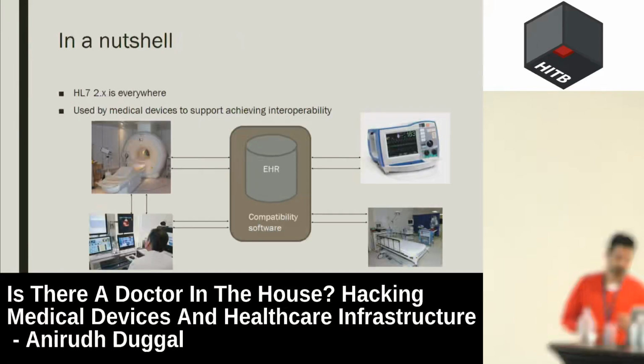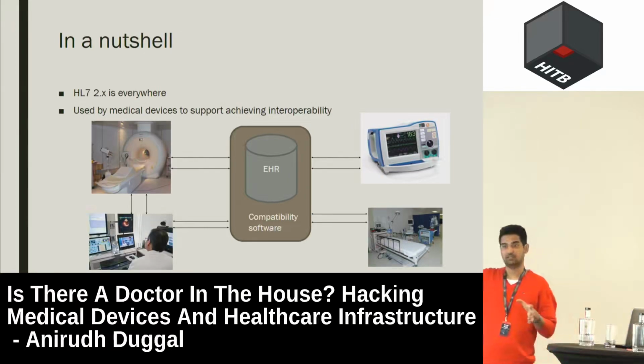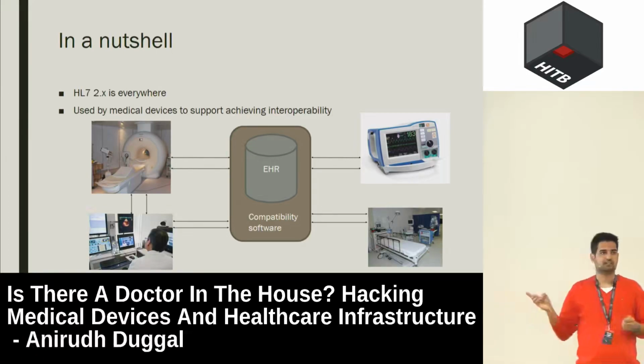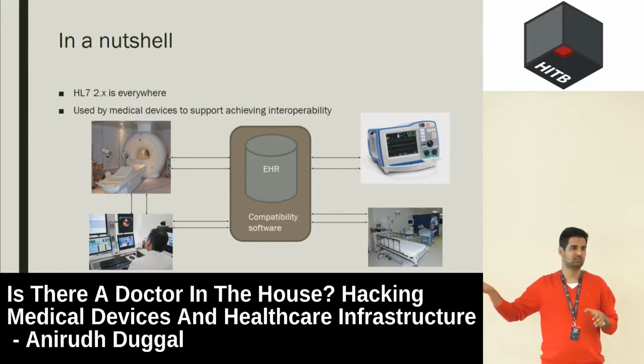In a nutshell, this means HL7 is everywhere. So you have the EHR, and remember the EHR. This is like our honeypot. This is connected to everything that's there in the hospital, right? Which means if you can take this guy down, you can do a lot of stuff.